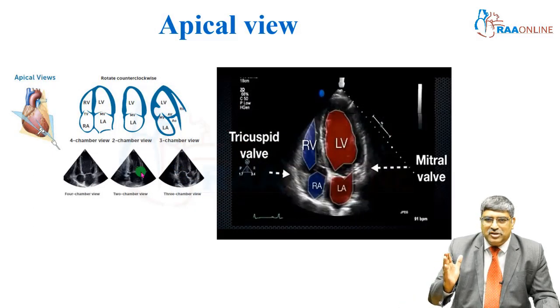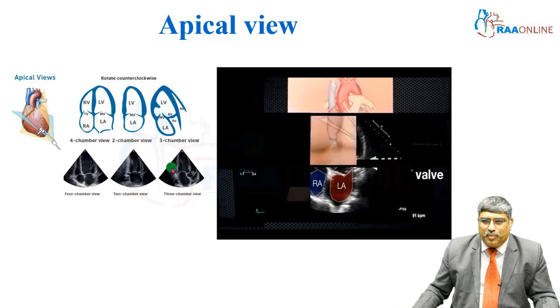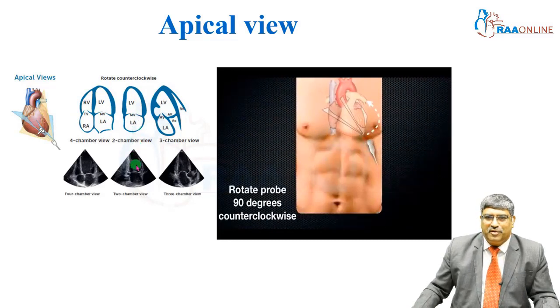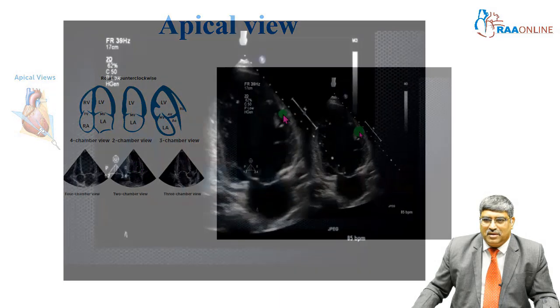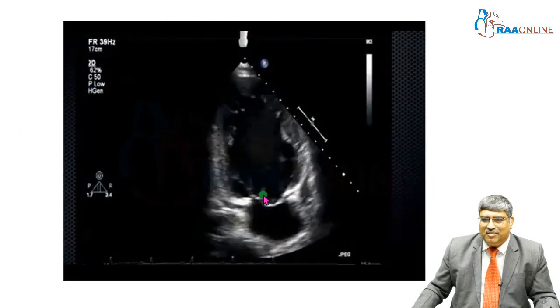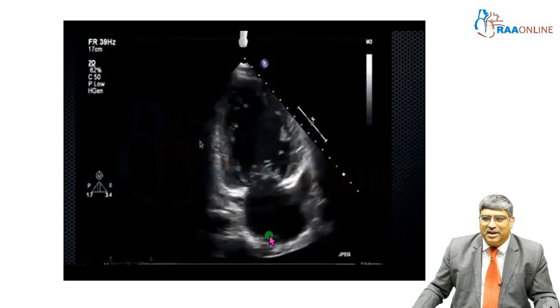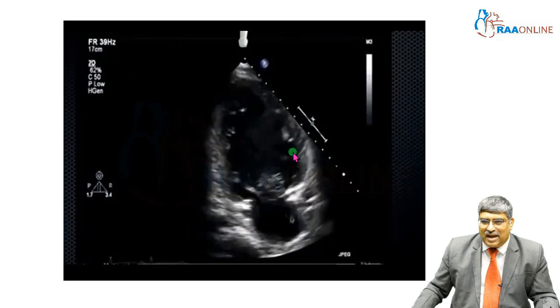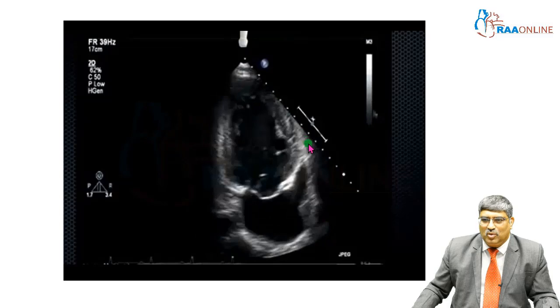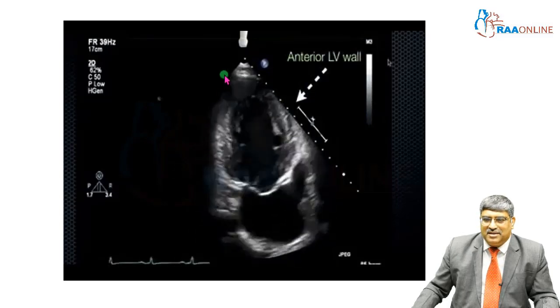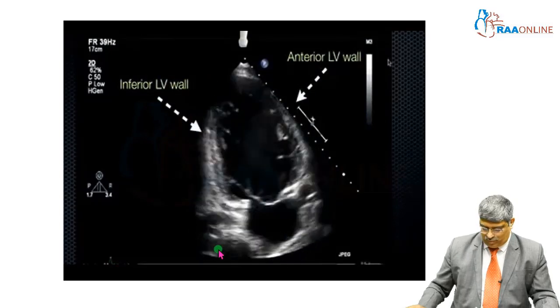As you rotate the probe counterclockwise at 90 degrees, you get the two-chamber view. Here you have the left ventricle, mitral valve, and the left atrium. This is the anterior wall and this will be the inferior wall.